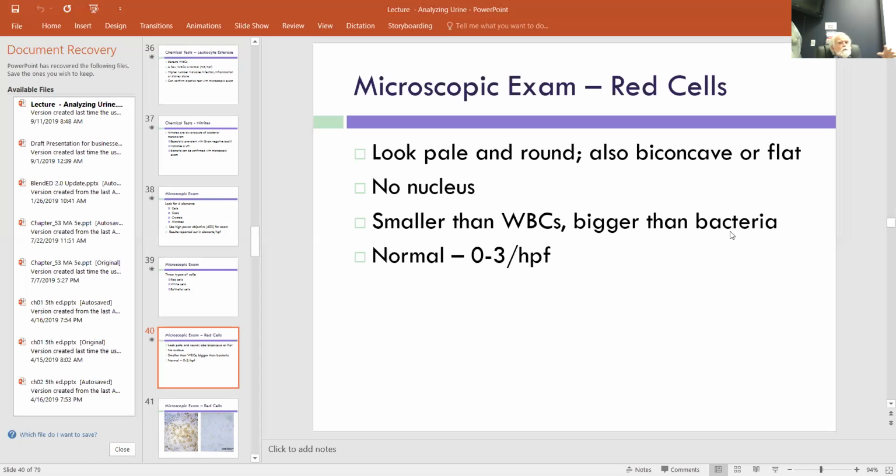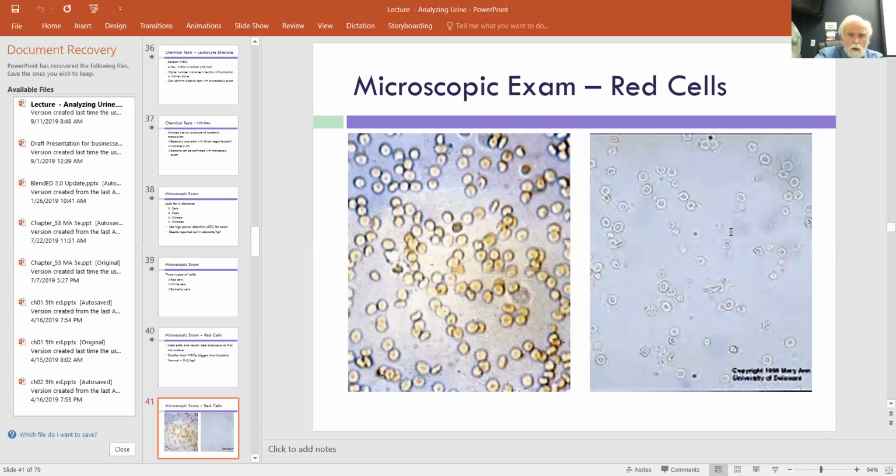When we start getting more, this is where the RBCs show up on the chemical analysis, usually as numbers. So this is something to look at from the chemical analysis. If the chemical analysis says there are red blood cells, you should be able to see them, because there ought to be enough, the way we prepared the slides.